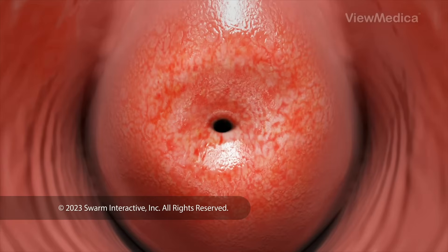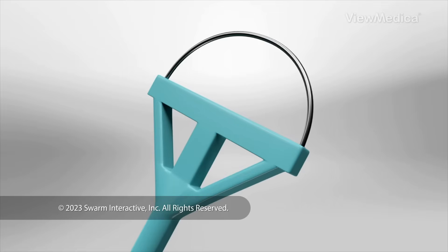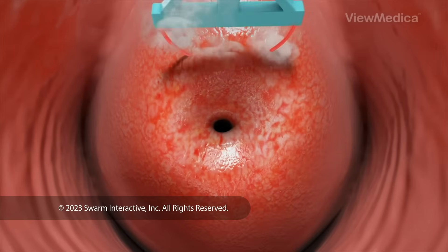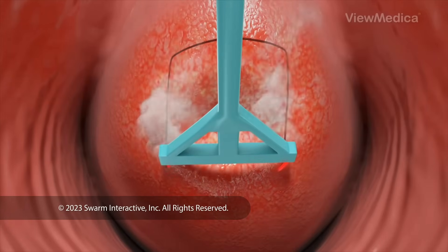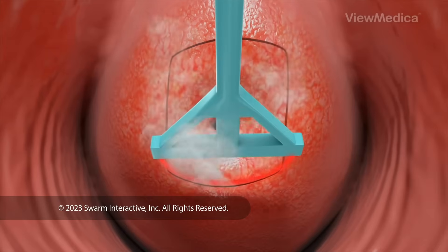Now, it's time to remove the abnormal cells. We do this with a thin device that has a loop of wire at the end. We charge the wire with an electric current. As we pass the loop across your cervix, it removes a thin layer of surface tissue. We collect this tissue for study.